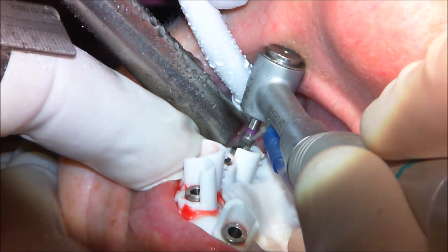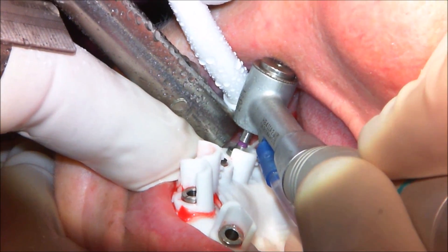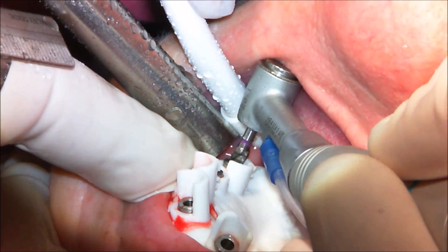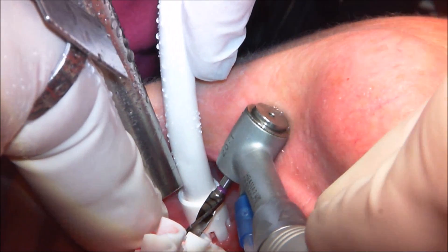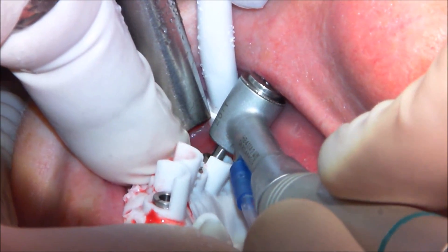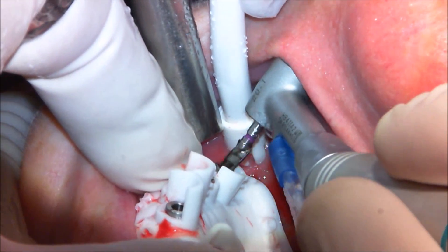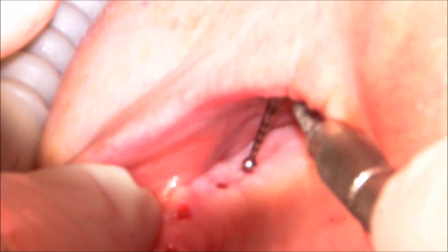Now we're doing our final osteotomy. This is going to be for a 4.3 by 6 millimeter implant — a fairly short site in the back. This was done to avoid the sinus because the patient had no bone volume posterior to that site.